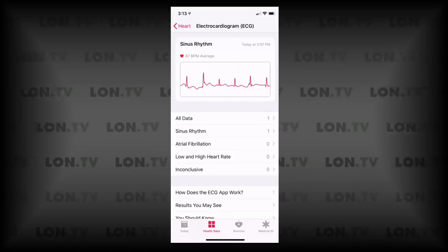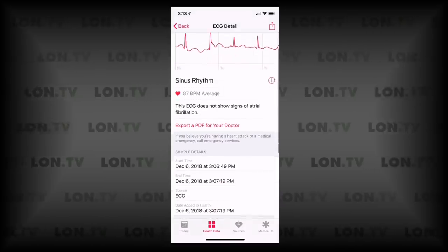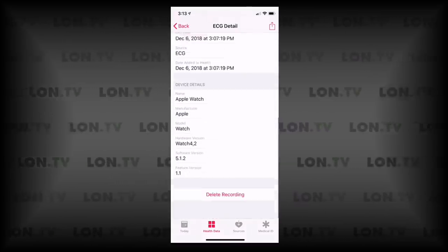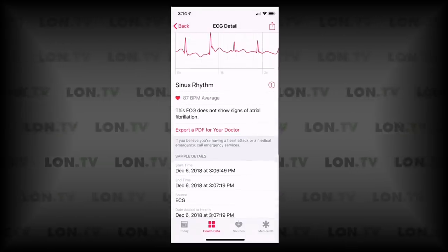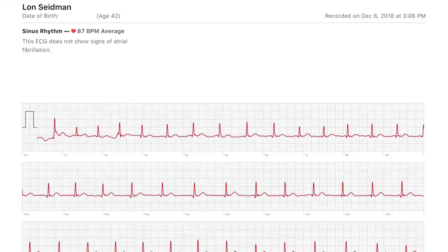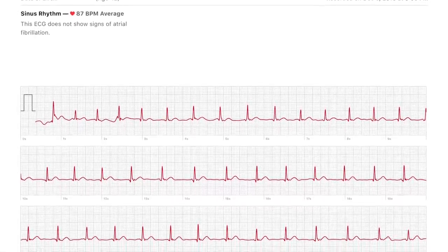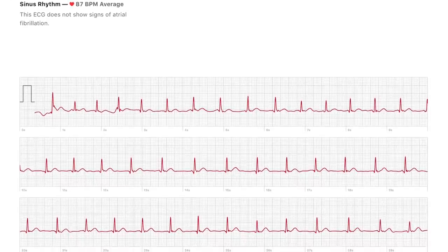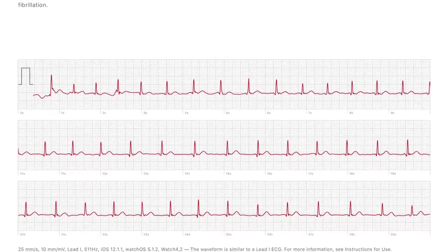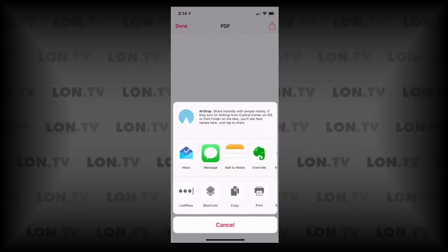That test at the top was the one we just ran. If I tap on that, I can get a bit more data about when it started, when it finished, what hardware I was using at the time, and I can also export a PDF to my doctor, which gives her the entire scope of my ECG as it ran. They might be able to do some additional diagnostics from this if you were having some kind of issue. You can just hit the share button and email it out.